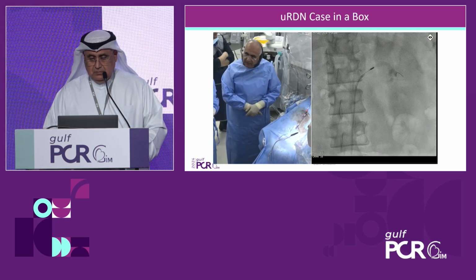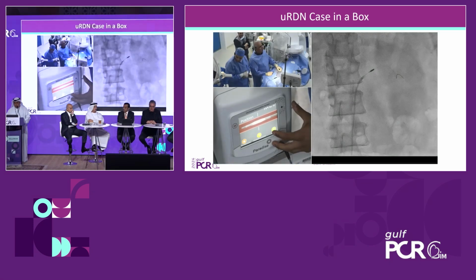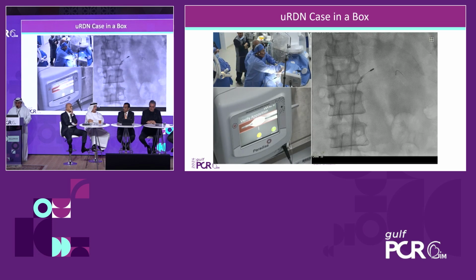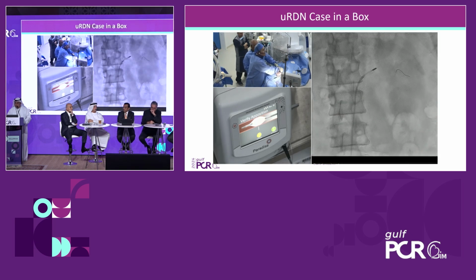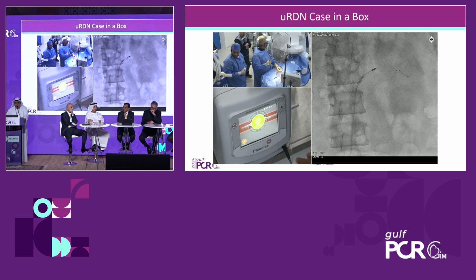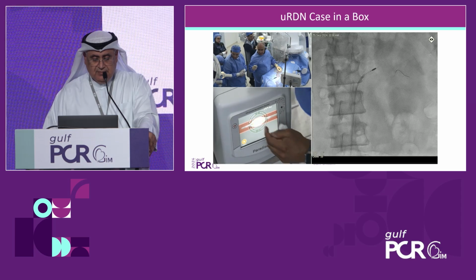Okay. You should hold the catheter while he's inflating. Yeah. Go ahead, please. So we'll start inflating the balloon. On the monitor again, inflated. It has been demonstrated nicely on the generator in the left lower corner. It's blocked nicely. We can inject. Let's start. And there was no leakage there. Yes, sonication, please. It takes exactly 7 seconds.